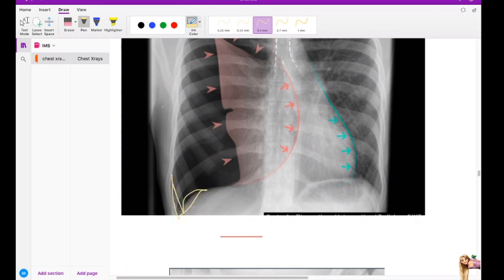It is not seen in A view. Actually, it is seen in AP view. No. Actually, it is seen when the patient is supine. So whatever view, when the patient is supine, then all the air collects into the basal and anterior regions. So that gives the sulcus sign. So the patient has to be supine. That is the important thing. Usually for pneumothorax we take erect, but if you're taking the patient supine, then there will be a deep costophrenic recess. And that is called the sulcus sign.